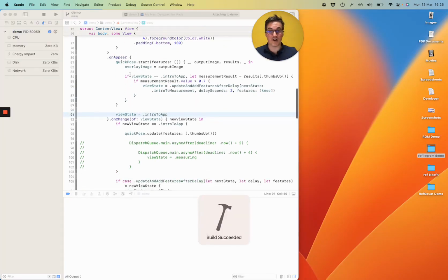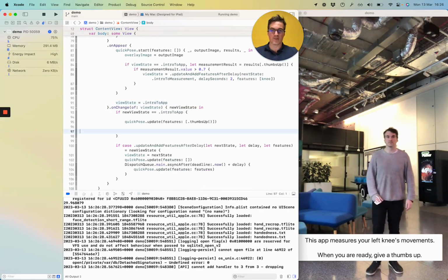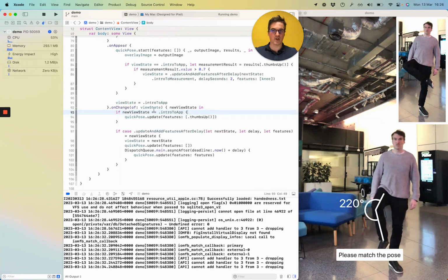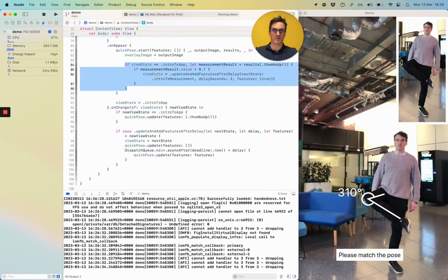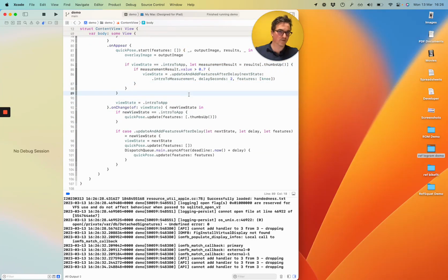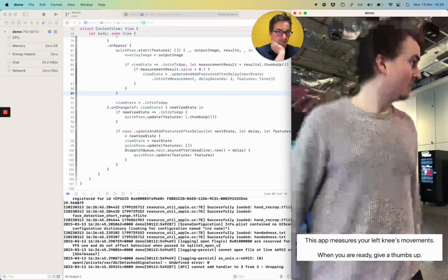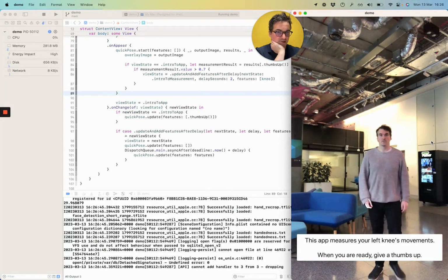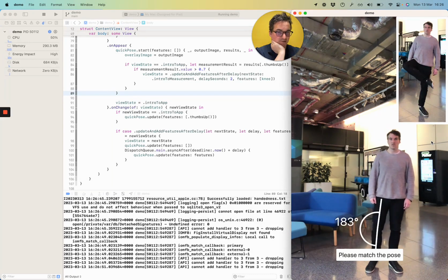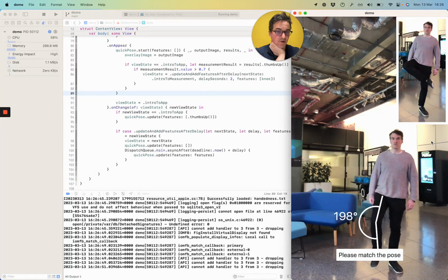Now you'll note the logic is changing from down here, where we're on the view state is changed, and we're pulling it up here to after a feature has been recognized. Sorry, I wasn't paying attention. Let's have a look at this from scratch. Okay, so we stand back. Thumbs up detectors there. Thumbs up, please match the pose. Great. And we had a little delay before the measurement tool came up.